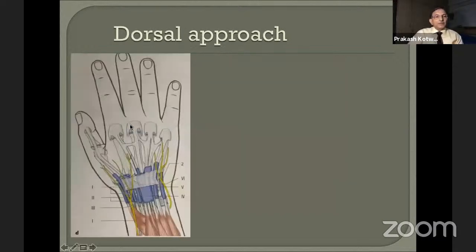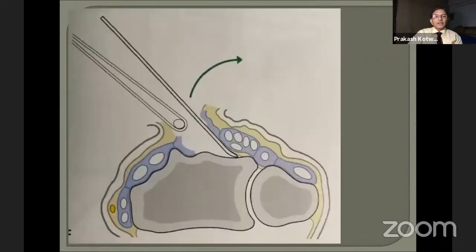Then you have this third compartment, that is the tendon of the extensor pollicis longus. You will release it from its compartment and bring it out and retract it radialward. Then you proceed, make an incision between the second and the fourth dorsal compartment. The fourth dorsal compartment is the compartment of the extensors of the digits. So you will make an approach through the second and the fourth dorsal compartments. And this is how you do it.